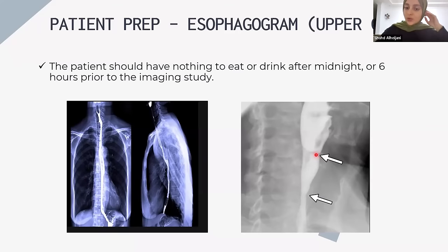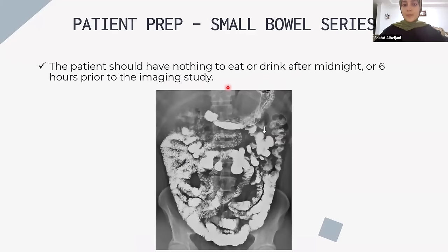This is an esophageal web usually. In other cases, you can see very narrowing, for example, in achalasia. In other cases, you can see obstruction in the esophagus. If you have an apple core appearance, it will be esophageal cancer. And you don't have to go into details, but this is what you have to remember for esophagogram.